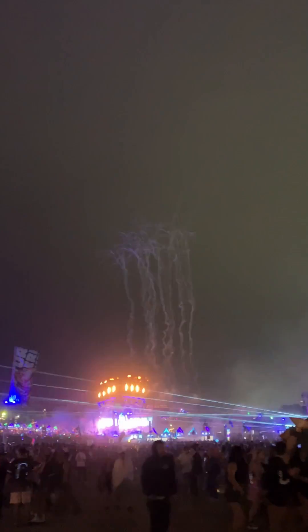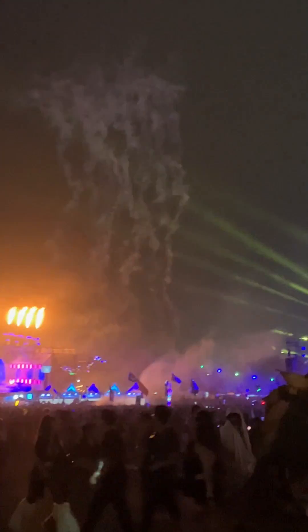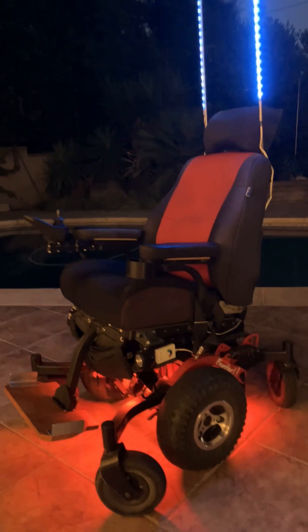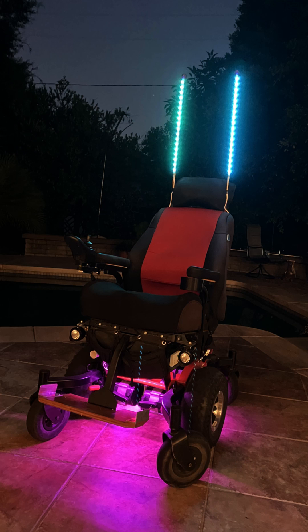I put the lights on the bottom of my chair and it was a big help in crowds of people because I can see their feet and try not to run anyone over. So not only do they look good but they are functional as well.